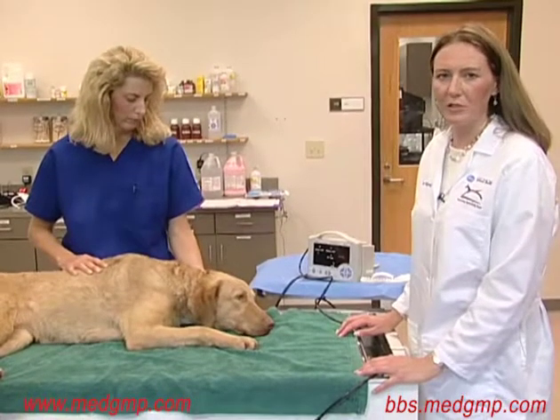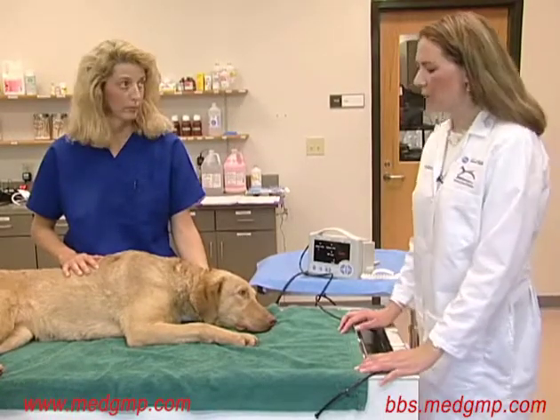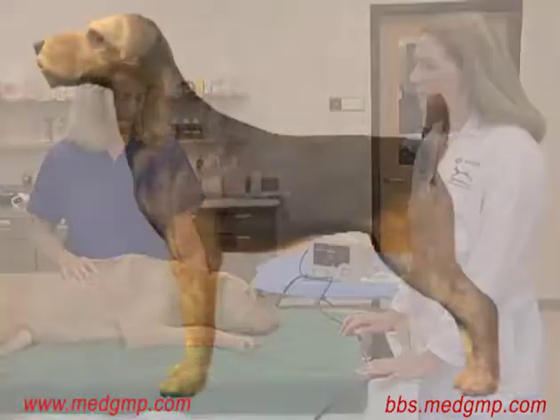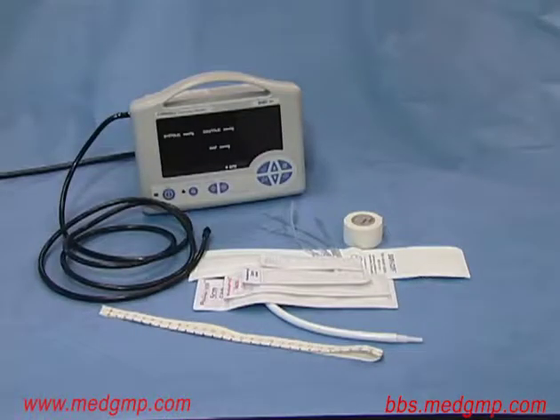The next method of blood pressure measurement we're going to demonstrate is the oscillometric method. This again requires placement of a cuff over a major artery. The best places to measure are basically just below the elbow, above the tarsus, or the tail in the dog. The equipment required includes the oscillometric blood pressure machine, a selection of cuffs, a measuring tape for determining cuff size, and some white tape.